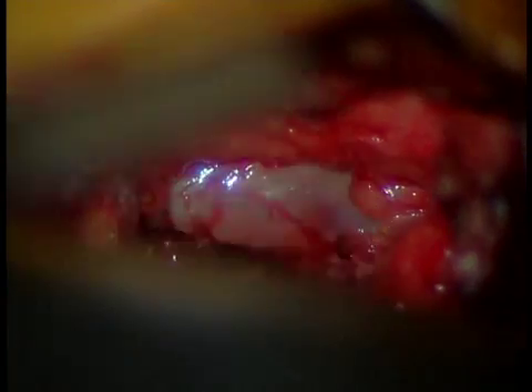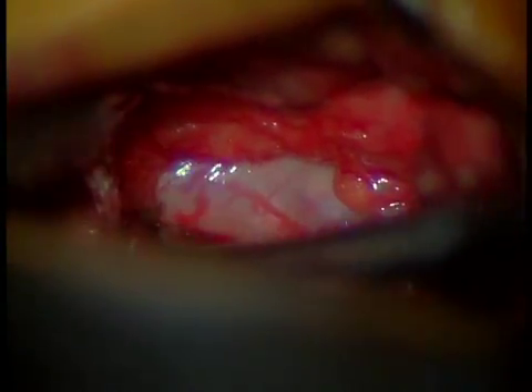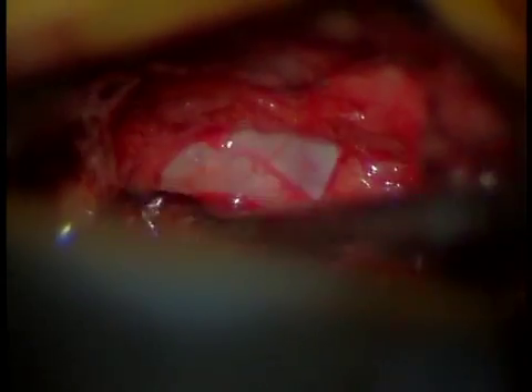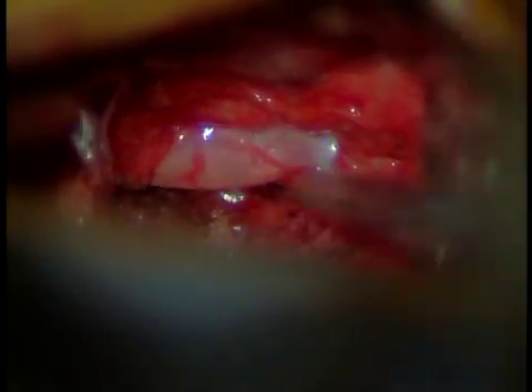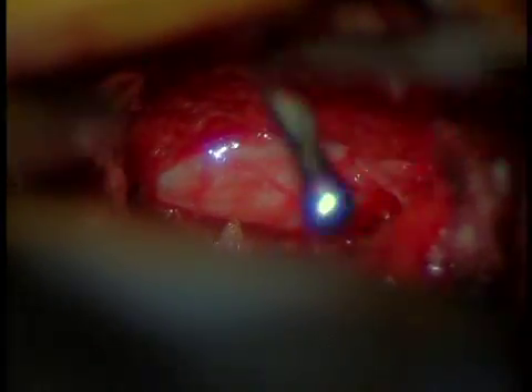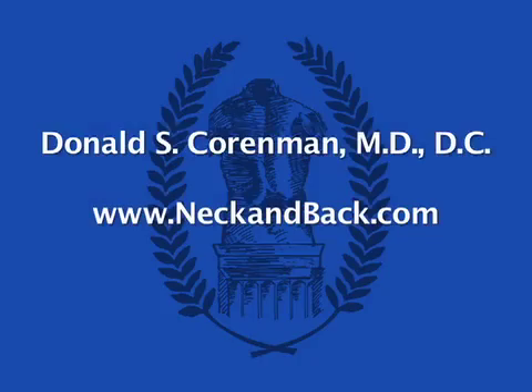Here you can see the nerve root is now free and we can probe underneath the nerve root to make sure that the nerve has total freedom. It should be able to move about a centimeter, and here you can see it does. We use a nerve probe underneath the nerve to make sure there are no fragments hiding and that the nerve is fully free. We go across the canal also. That consists of the entire microdiscectomy for the lumbar spine.